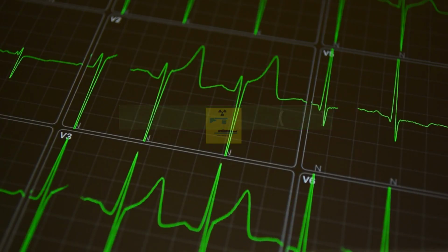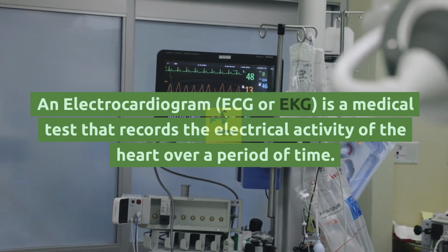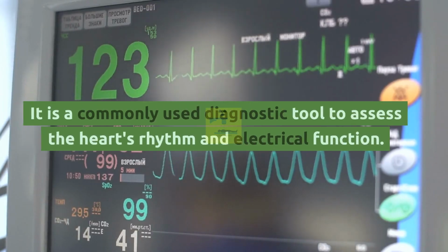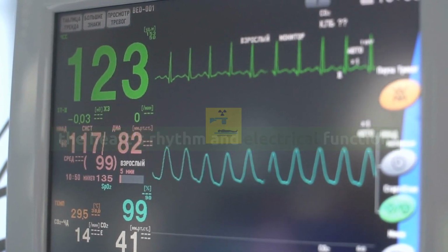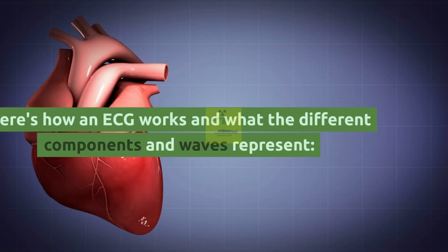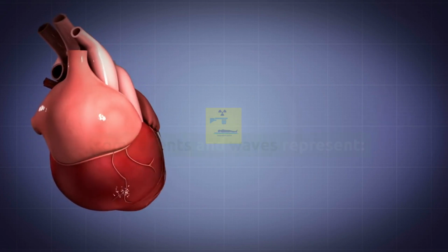Electrocardiogram, ECG. An electrocardiogram, ECG or EKG, is a medical test that records the electrical activity of the heart over a period of time. It is a commonly used diagnostic tool to assess the heart's rhythm and electrical function. ECGs are valuable for detecting various heart conditions and abnormalities. Here's how an ECG works and what the different components and waves represent.